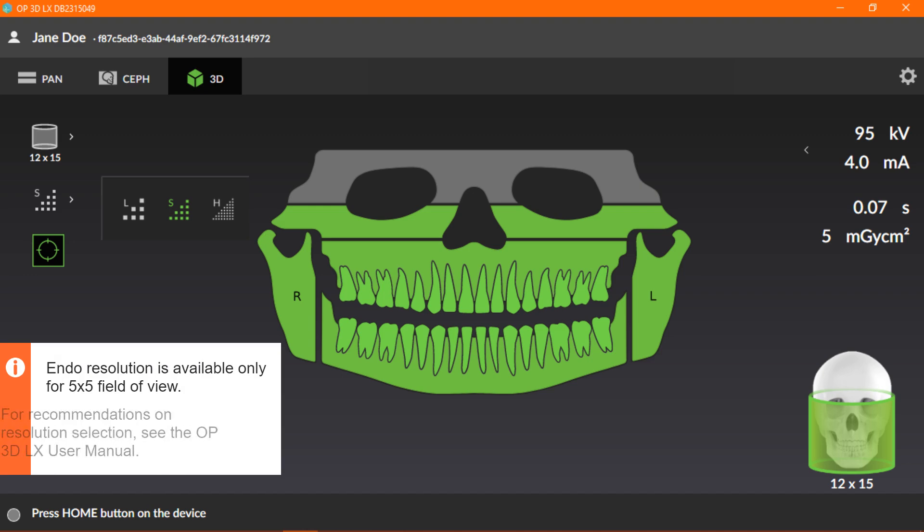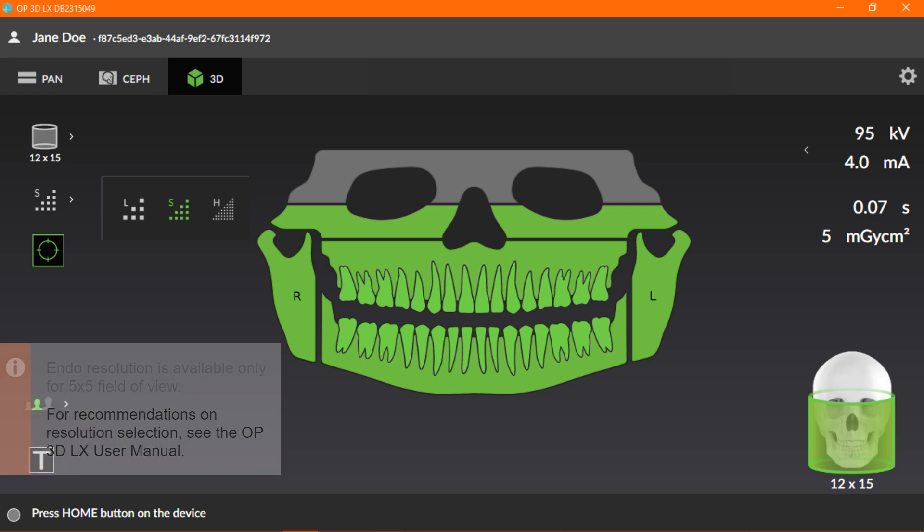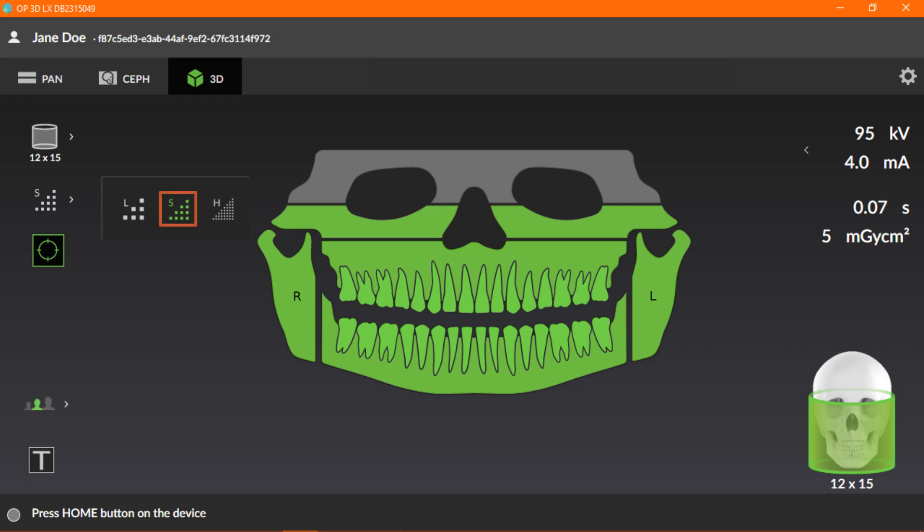For recommendations on resolution selection, see the OP3D LX User Manual. For this example, we'll use the default standard resolution.